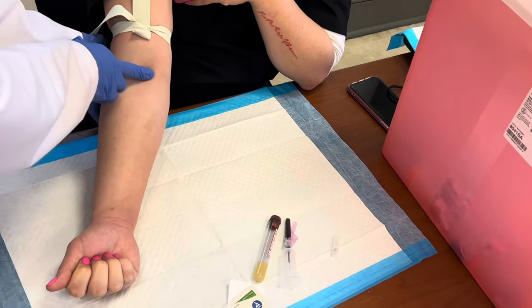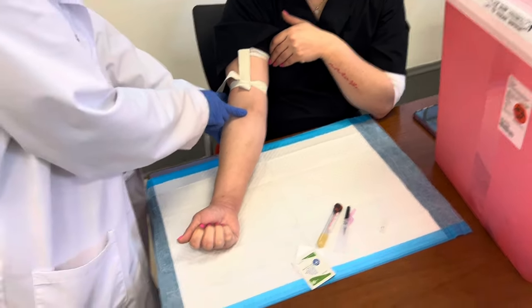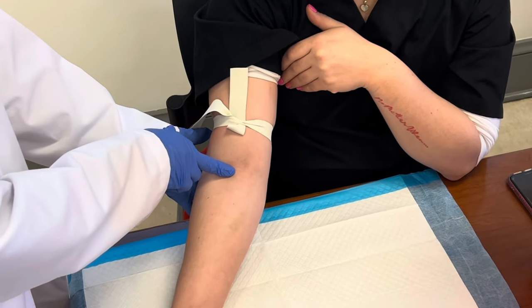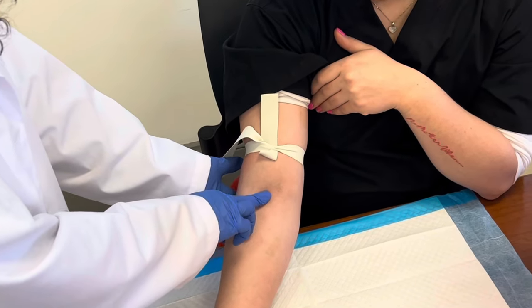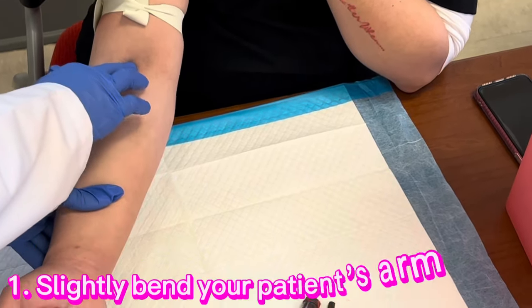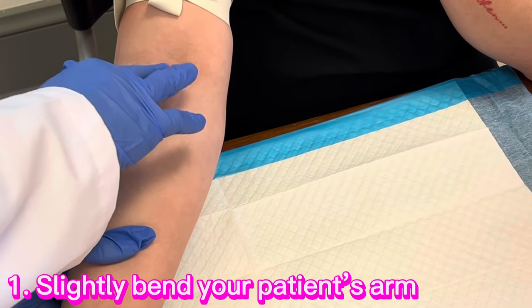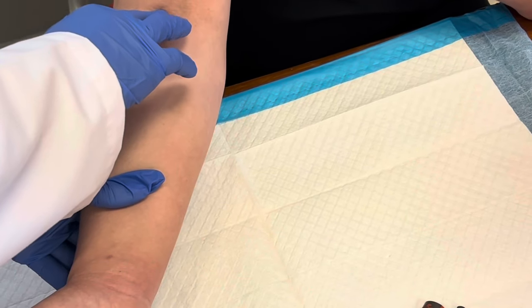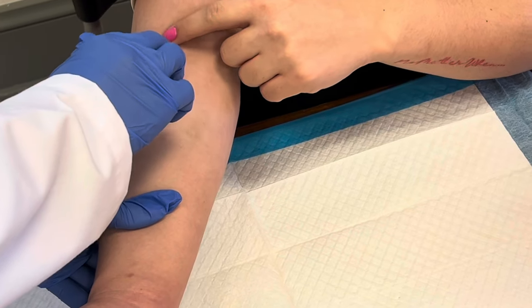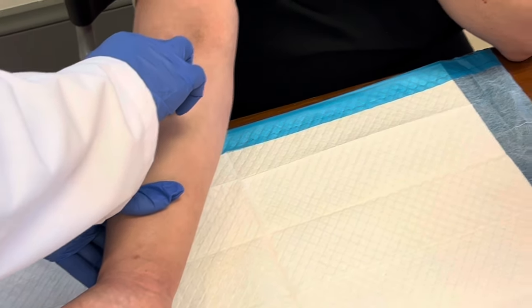Now I'm going to feel here for her veins — I'm going to palpate. One thing that I always do to find a difficult vein: you can kind of bend her arm a little bit like this. When you bend her arm, you can feel the vein a little bit better. That tends to help as well.